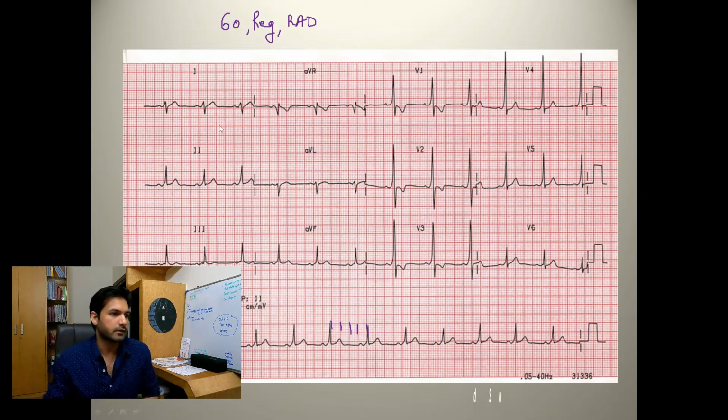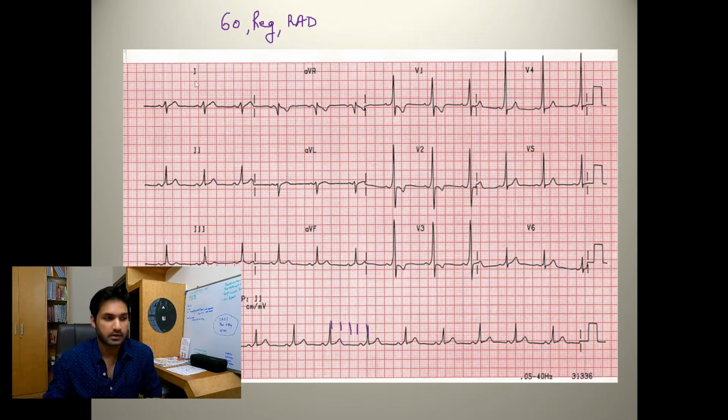So over here, I told you one crude method of checking if it's LVH or RVH. Is that right reaches? Over here we see that the negative deflection is bigger than the positive one, and in lead 3 the positive deflection is bigger, so they're reaching towards each other, so right reaches. So yes, it does point towards right ventricular hypertrophy.